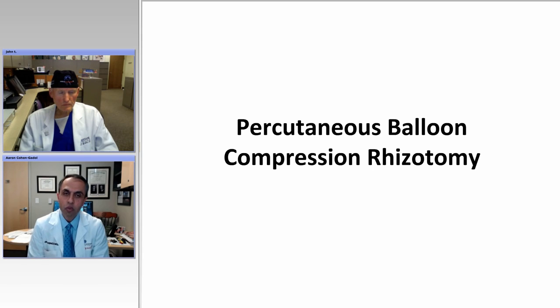Number two is, what about a patient who has a V1 trigeminal neuralgia? I think balloon is an excellent procedure, or a glycerol rhizotomy. Number three, which I would like to ask your opinion, what about if the patient who has trigeminal neuralgia in all three divisions? How would you argue about those points that are disadvantages of radiofrequency rhizotomy?